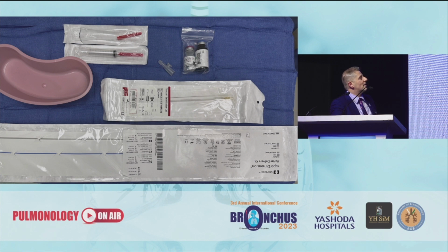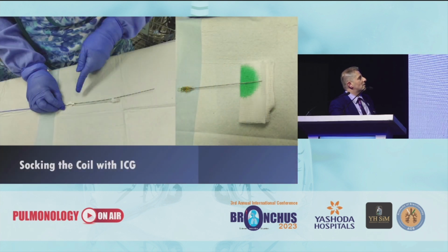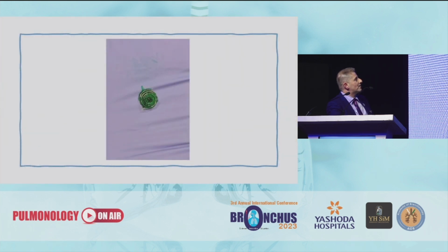After mixing the ICG and putting it together, we were able to flood the coil with the ICG to make it soaked, so that the fibers become soaked with the green, and then we uploaded it into the deploying system by pushing the fiducial marking into it. This is a picture of a coil already soaked with ICG, and you can see the signal of the dye is really saturated on that coil.